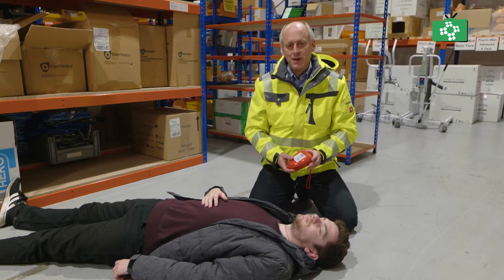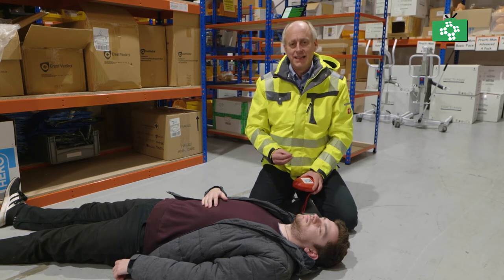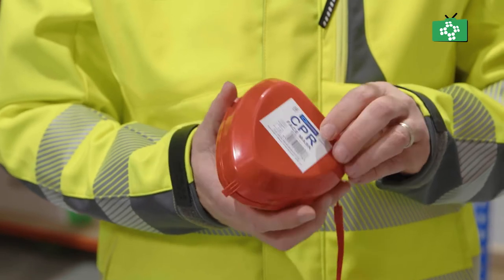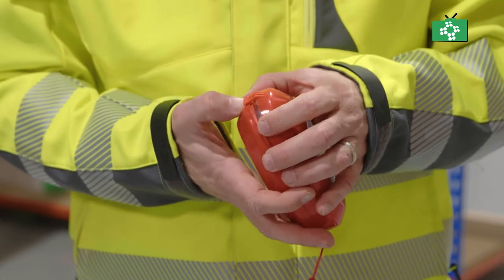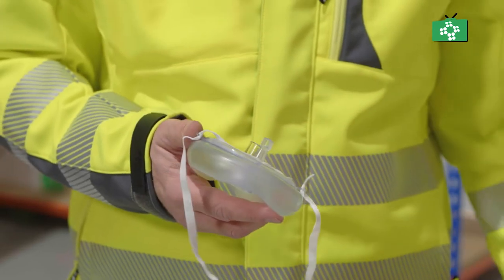What we're going to do now is look at the pocket mask and how that's used in resuscitation. One of the fears of first aid is coming into contact with someone else's body fluids when you're doing the breaths for CPR, so the pocket mask is a very good way of stopping that. It's slightly more bulky than other face masks but a lot better. It comes in this plastic case and you just open up the case and remove the pocket mask.